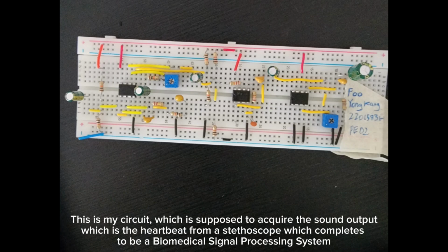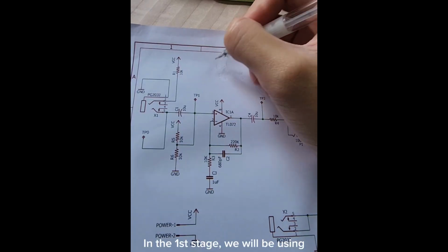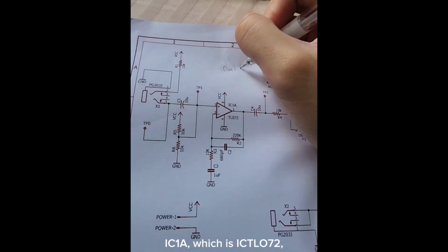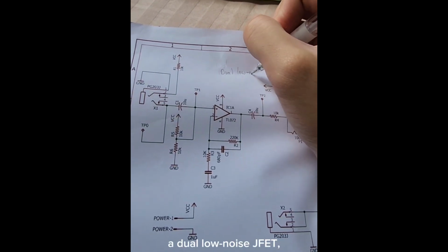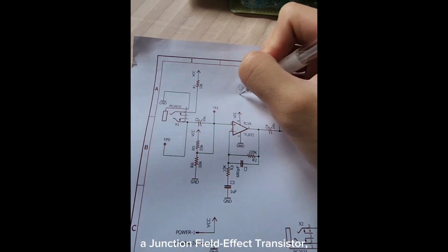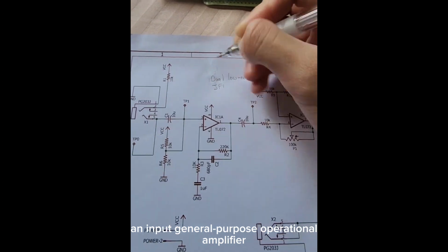This is my circuit, which is supposed to acquire the sound output, which is the heartbeat from the stethoscope, which completes a biomedical signal processing system. In the first stage, we will be using IC1A, which is a TL072, a dual low noise JFET, a junction field effect transistor, input general purpose operational amplifier.